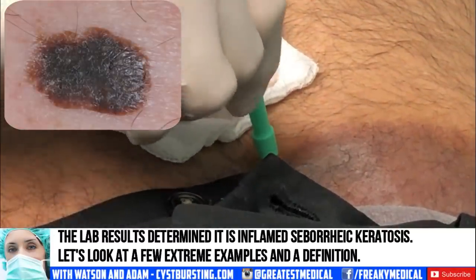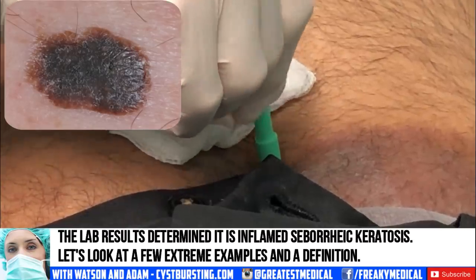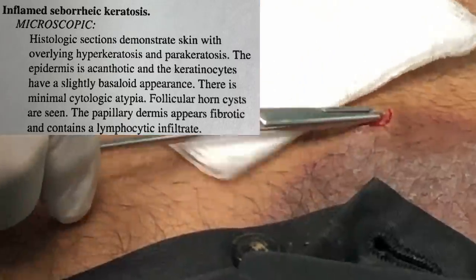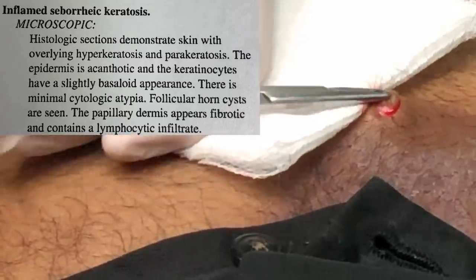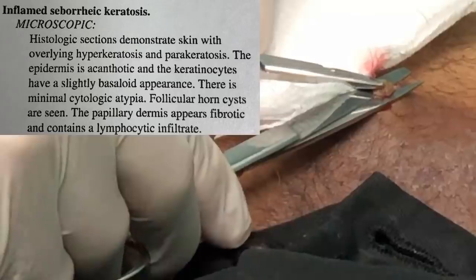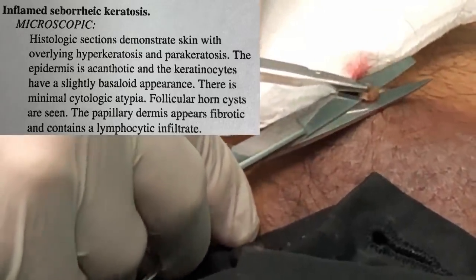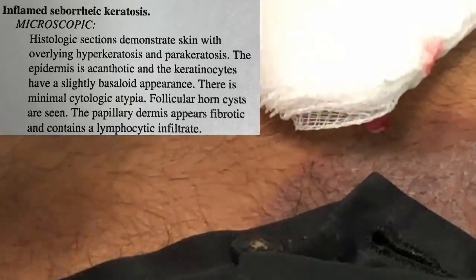I'm just pushing down while I twist gently. We're just going to grab that right there. I'm going to take the scissors and just go right underneath — snip that off. Came right off and we're going to put this in the specimen cup.